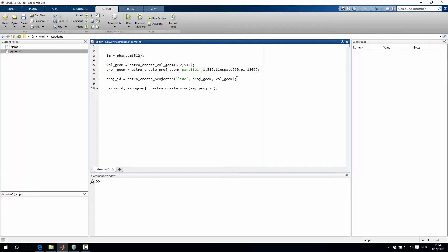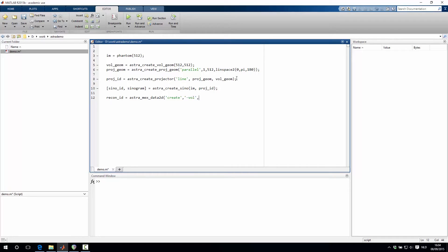The next step is to create a reconstruction volume. So we create this by typing astra_mex_data_2d. We say create a volume object with this volume geometry, and we want to initialize it to 0.